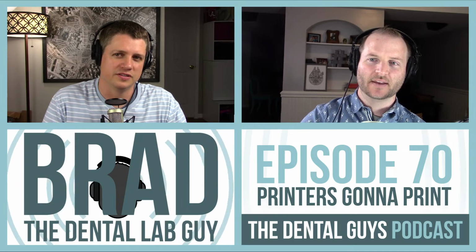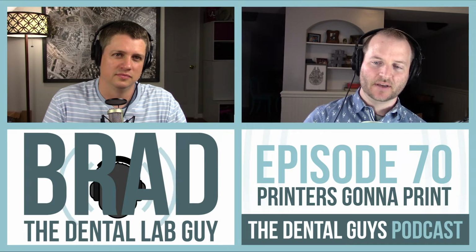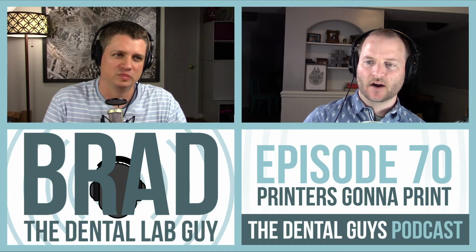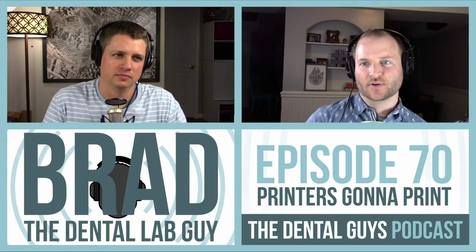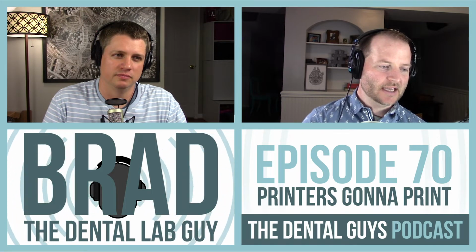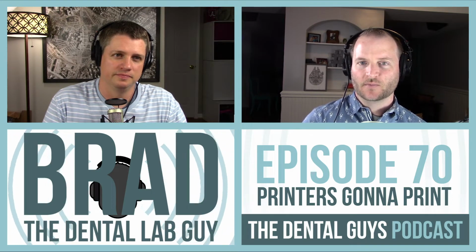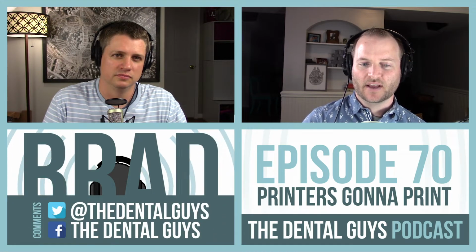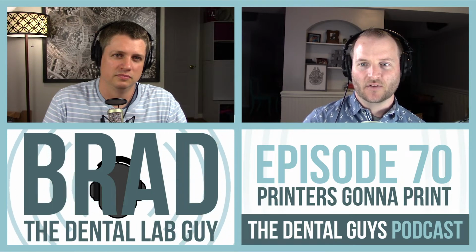Some limitations. I think we should just talk about that. I know we had that later in the outline, but I want to stop there for a second and dwell on it, because I don't hear it talked about a whole lot. I remember when I was at the ADA meeting last year, walking around talking to printing people to see what they had to say. I went to one company and said, show me what you have for materials. They said, we've got this, and this, and this. And then they made a point. They said, we have to tell you that these are not FDA approved for use in the mouth.